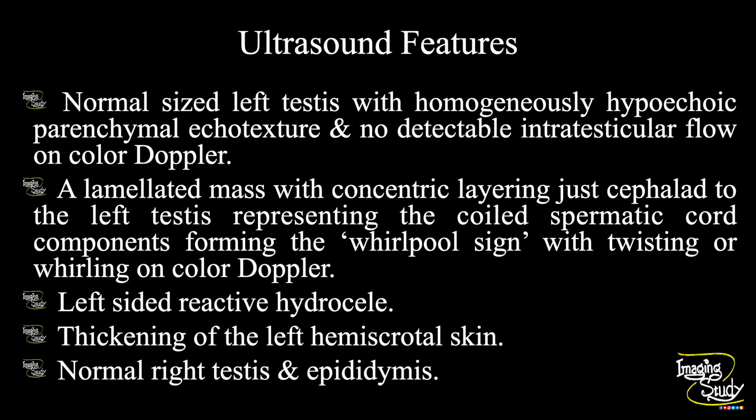In summary, a normal-sized left testis with homogeneously hypoechoic parenchymal echotexture and no detectable intratesticular flow on color Doppler is seen. A lamellated mass was noted with concentric layering just cephalad to the left testis representing the coiled spermatic cord components forming the whirlpool sign with twisting or whirling on color Doppler.